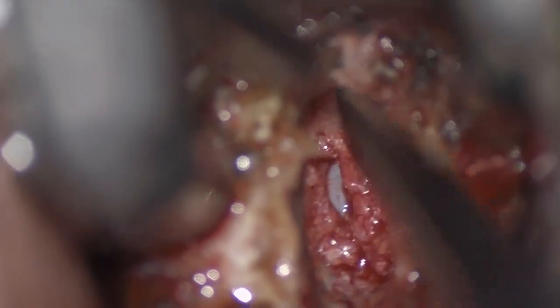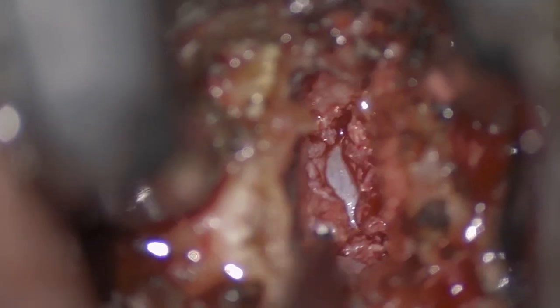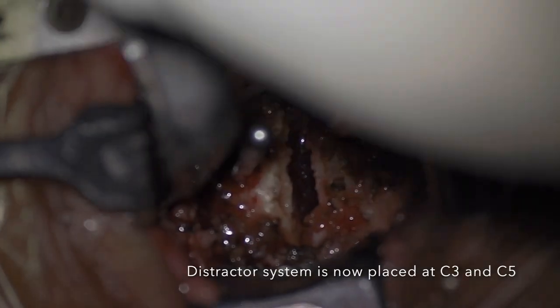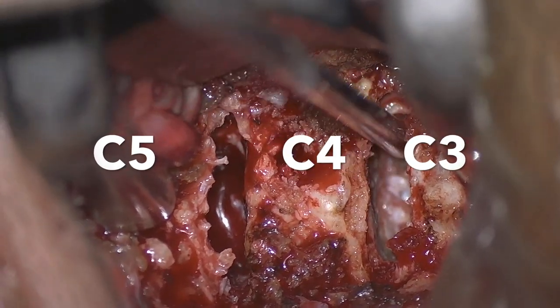A 1 mm rongeur is used to safely remove the remaining part of the posterior longitudinal ligament. It is important that the PLL is removed from uncus to uncus and the cord is completely decompressed before ending the discectomy. Again, the adequacy of the decompression is confirmed using a ballpoint probe. The distractor pins are then shifted to C3 and C5, and we are ready to start the C4 corpectomy.